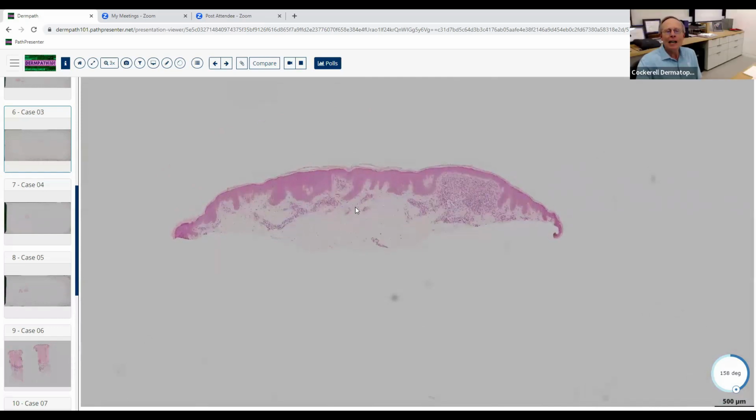Okay. Yeah, I think that they're elongated, they're kind of bulbous in a way, but I don't really say that there would be a classic interface dermatitis or a diffuse lichenoid infiltrate that sort of wiped out these epidermal rete over here. Maybe here, not over here. There's one focal area of nodular inflammation, making the epidermis in that area a little bit more atrophic. Good. I totally agree. It's wiped out the epidermal rete up here completely.